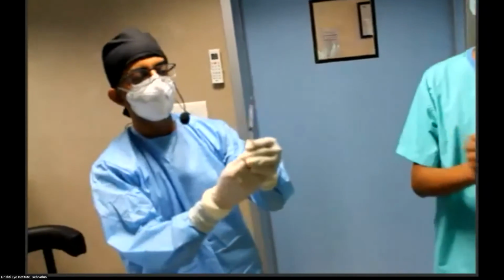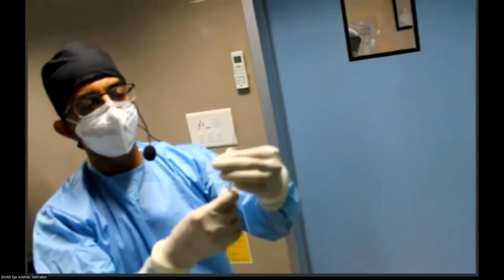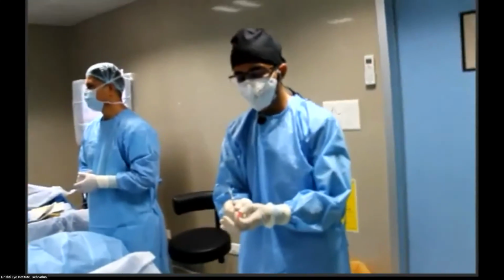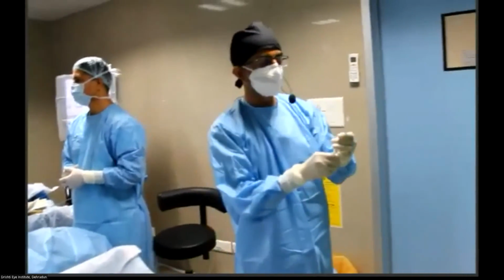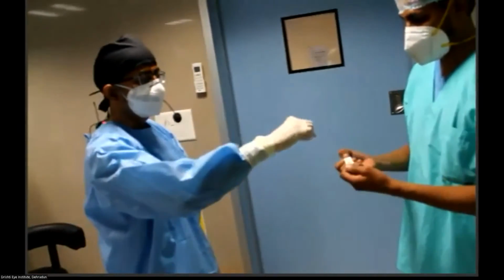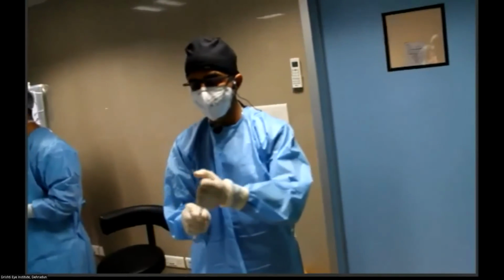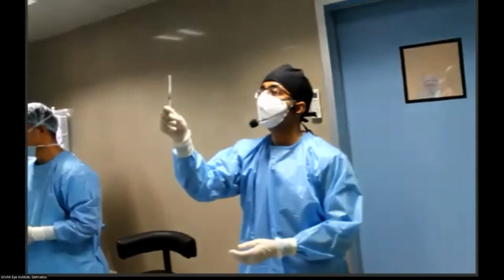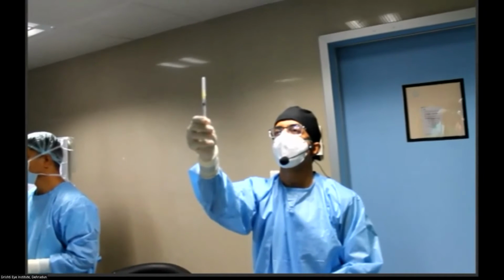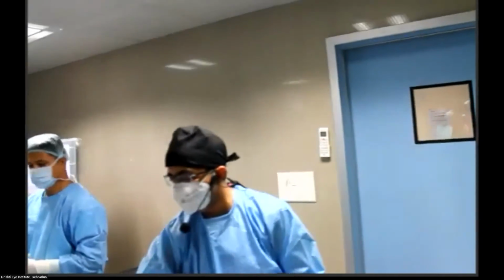So I managed to get almost the entire volume of the injection inside my 1 cc syringe. Now I take off the filter spike needle, and then I will just attach a 30 gauge needle to this, which we will be using for injection. Now I'll discard the air from this and make sure that the injection is ready to be used.